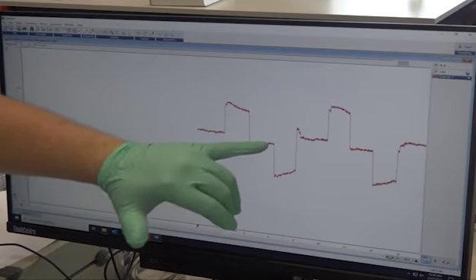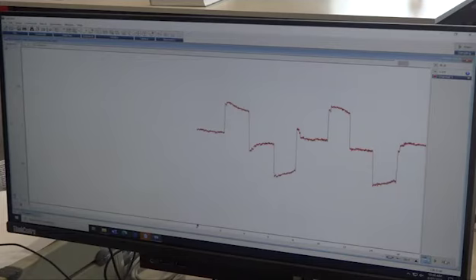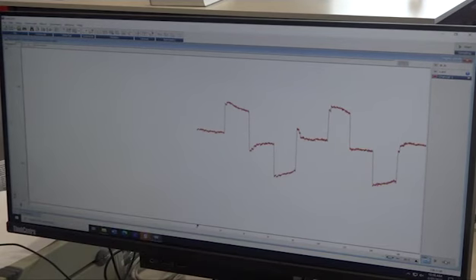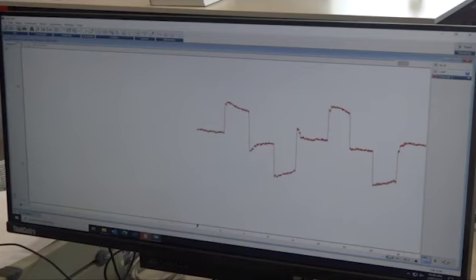And then the signal goes even more negative because now we've shifted our gaze even further to the right and closer again to that negative electrode. Once again, the signal goes flat as we're focusing our gaze on a particular spot towards the right, and then the signal once again goes positive as we move away from that negative electrode back towards the center.